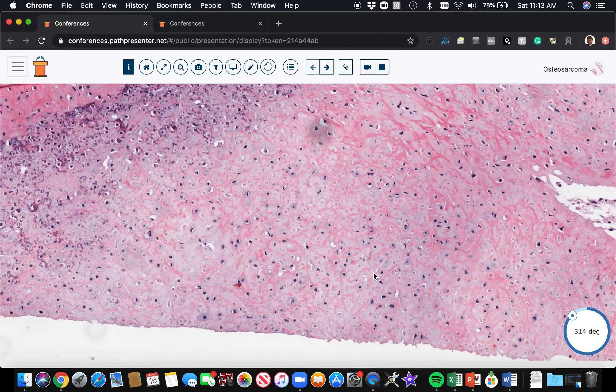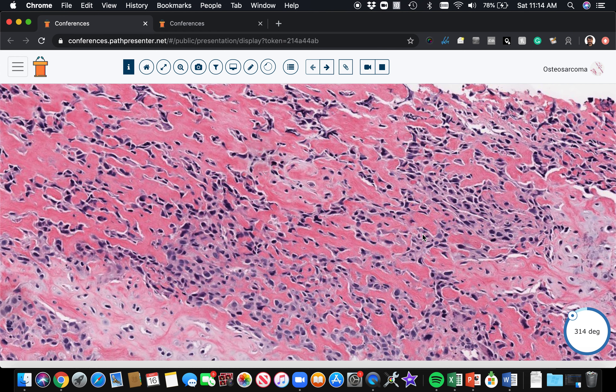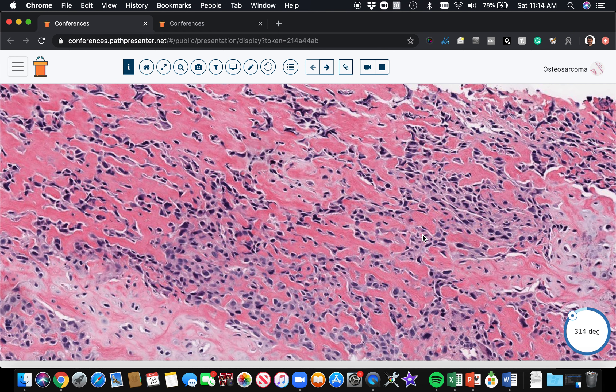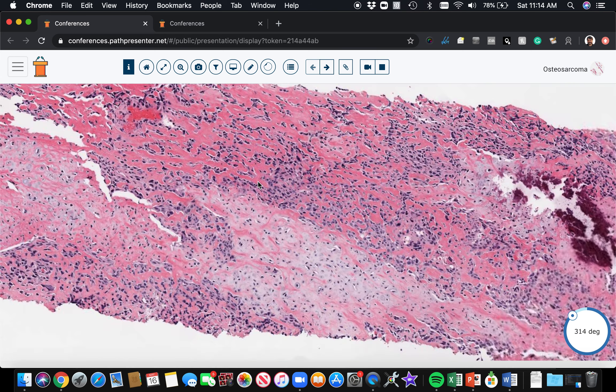When you see atypical cartilage in a young patient, always think of chondroblastic osteosarcoma before chondrosarcoma, because young people don't usually get chondrosarcoma — that's a disease usually of older adults. This is an example of the atypical chondroid areas you can see in chondroblastic osteosarcoma. As far as genetics go, two genes to always keep in mind for osteosarcoma are the retinoblastoma gene RB and the P53 gene. Patients with germline retinoblastoma abnormalities have a higher risk of osteosarcoma, and patients with Li-Fraumeni syndrome and germline P53 abnormalities are also linked to osteosarcoma.